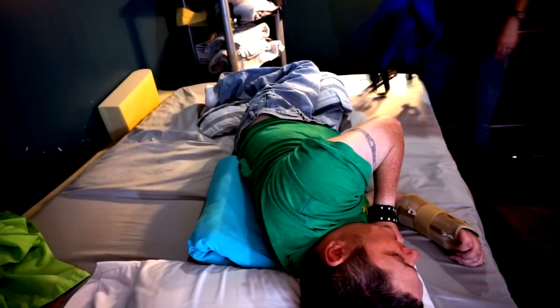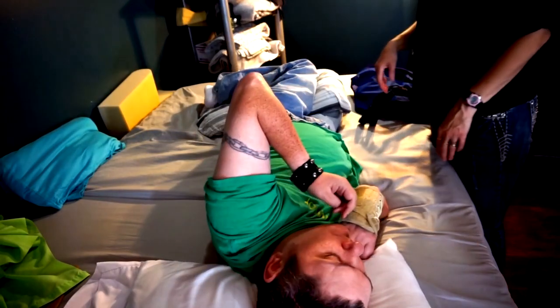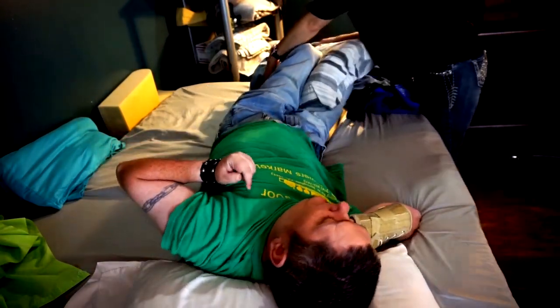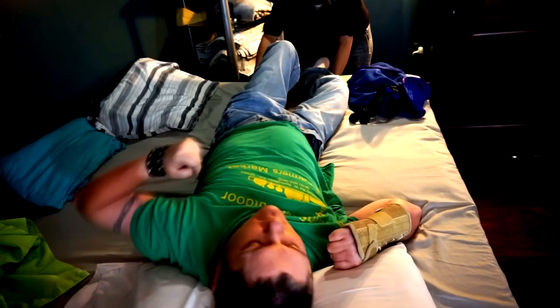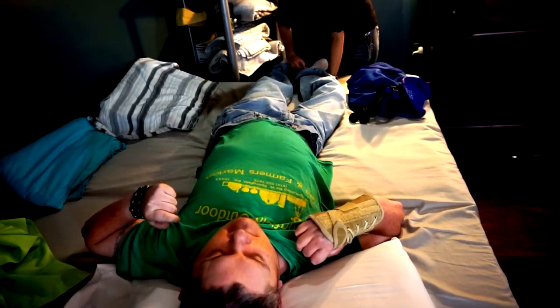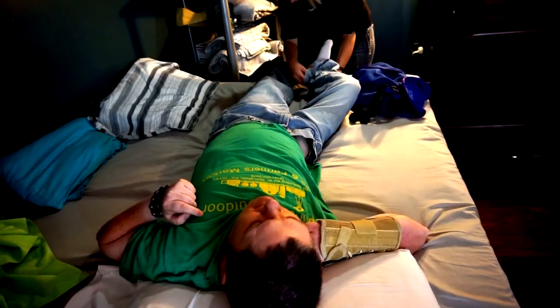Hey guys, I want to talk you through how I do my Hoyer lift into my new Amy Systems chair. First, what I do is I pull my back pillow and my leg pillow out and I lay flat on my back, and I get all the spasms out before I go rocketing into the air and shaking all about.